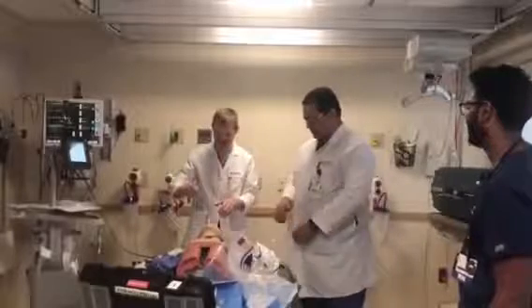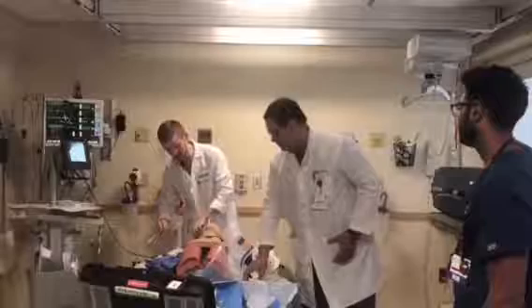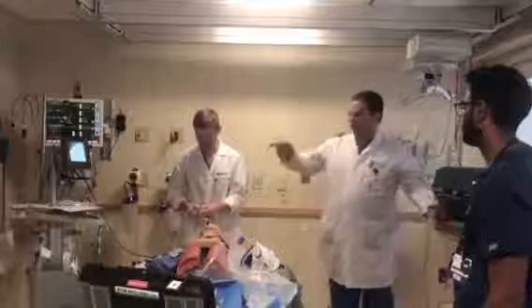Okay, wait. Oh, he missed a step. He missed a step. Oh, I gotta inflate. No, I inflated. Oh, I gotta inflate this thing. Yeah. No, but that's not the step. That's inflated. He missed the step. Him a little bit. That's right.